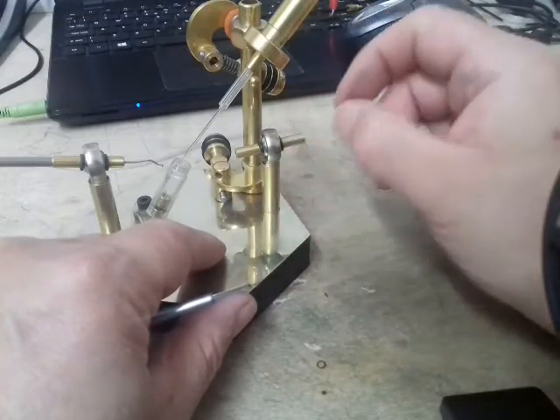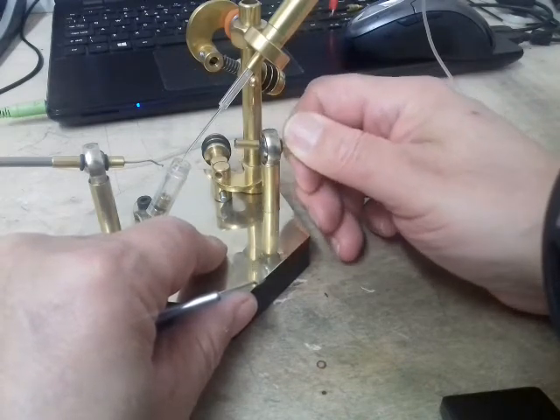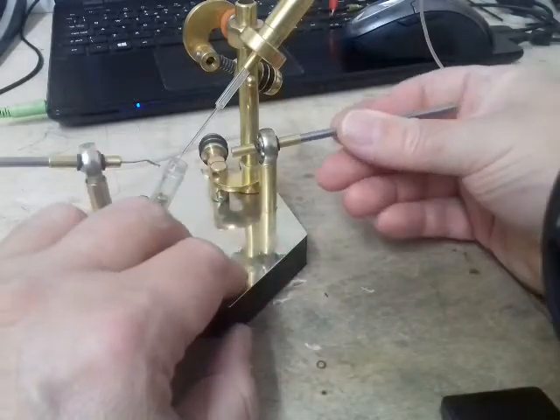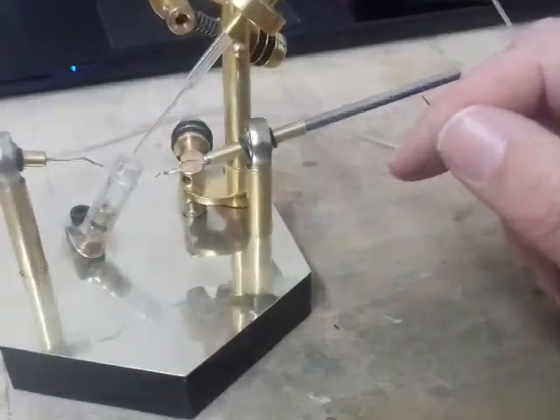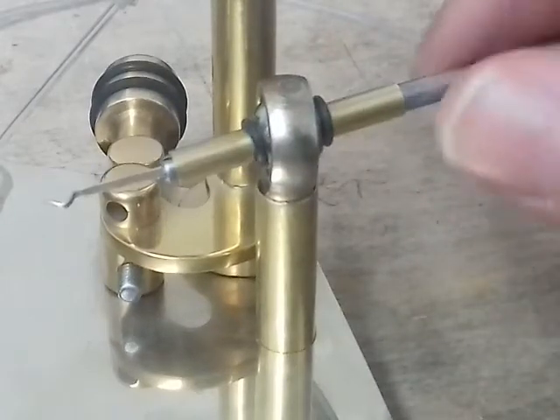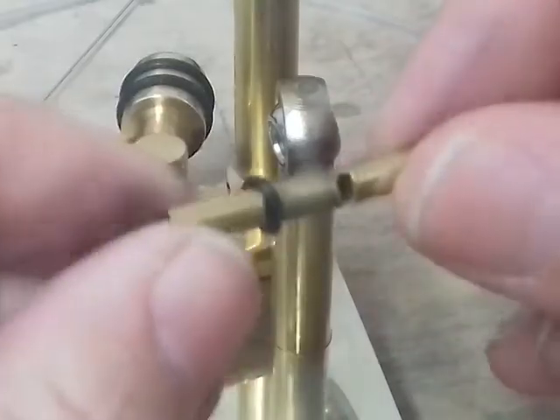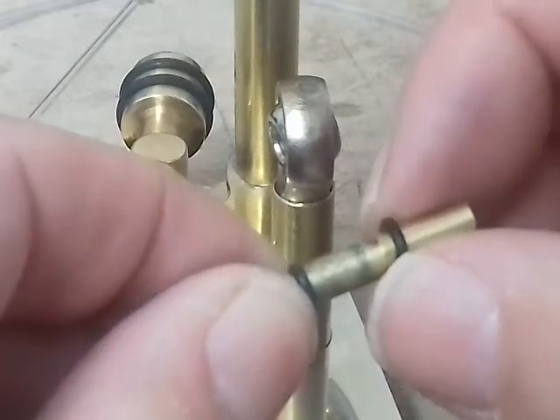So you could put a little nip screw on to alter it, but I find it'll take a long time to wear, and when it does you could take the extra effort and put a little nylon nip screw in there. Still, there's scope for doing different things. But these work so well with these two rubber O-rings either side, which nip down through the slots. I think I've shown you that before, but I'll show you again. If I take that tube out of there, you've got two cutaways, so when you put the rubber O-ring over the top, that nips down into the tube.